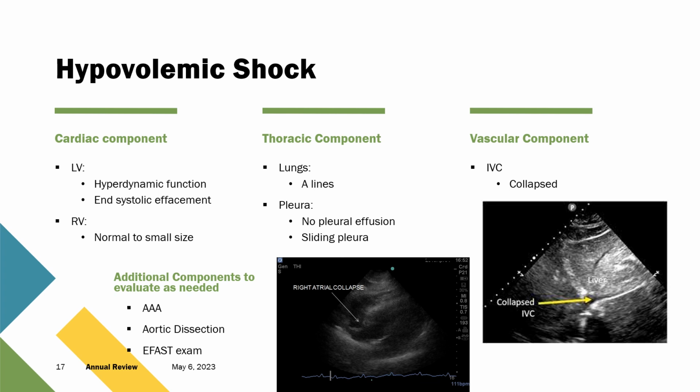These can be a little bit more difficult to evaluate, but when you're looking at your aorta, if you see a thin echogenic line and add blood flow to that aorta near that thin echogenic line, and you see that the aorta is being filled with blood in a false lumen, not in the true lumen, then that would be indicative of an aortic dissection.